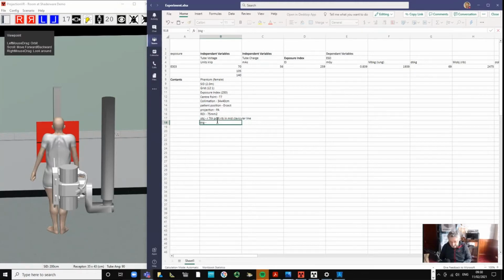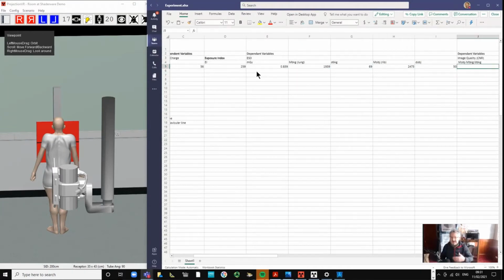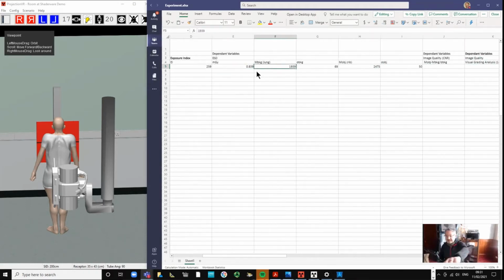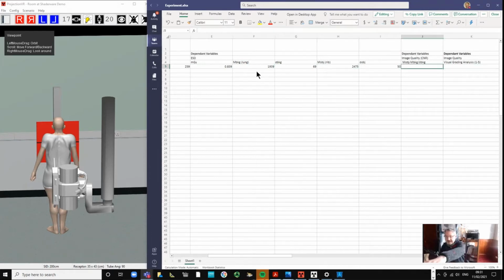And the background is the left 6th costal space in mid-clavicular. All that anatomy comes in handy, doesn't it? So a multidisciplinary team doing this sort of research, which includes radiographers, physicists, radiologists, is by far the best. Okay, we need to collect the rest of the data, so we can do that calculation.